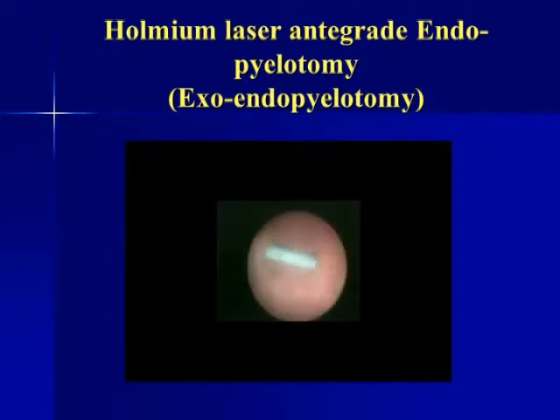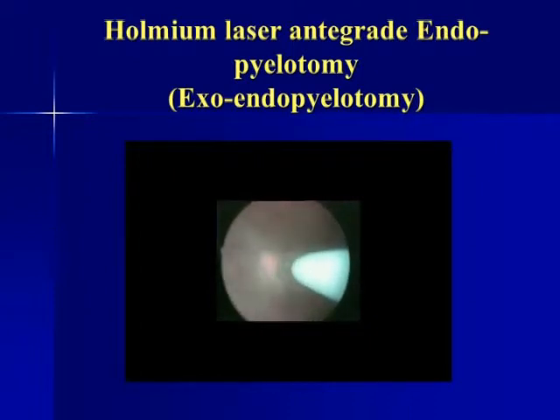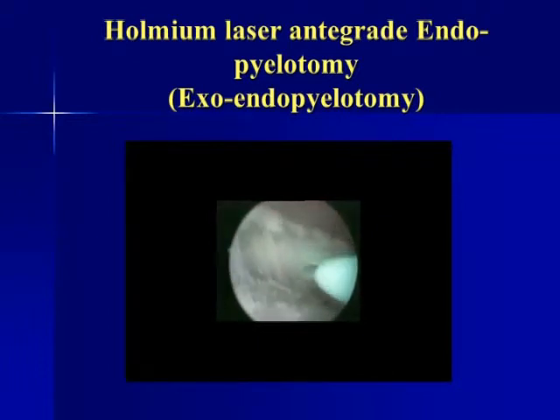This patient had multiple matrix calculi which were initially removed. We can see a small PUJ with a ureteric catheter across. I do use a resectoscope with a laser bridge from above through the Amplatz sheath, and to make it watertight we usually use a nipple of a nephroscope or laparoscope to seal the Amplatz sheath. With a laser energy of around 10 watts, we usually cut the fibers. We can see each and every fiber separately and cut it precisely.